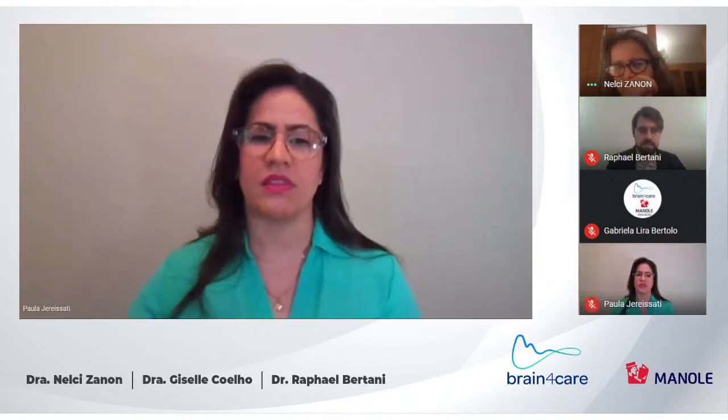I think especially in cases like hydrocephalus with a programmable valve, we can define the right pressure for this child. I recently had a case where I could define the best pressure for the valve for a child after the non-invasive ICP model. And it's really important for the child, for quality of life. And she became asymptomatic after this monitoring. Then I think it's so important.